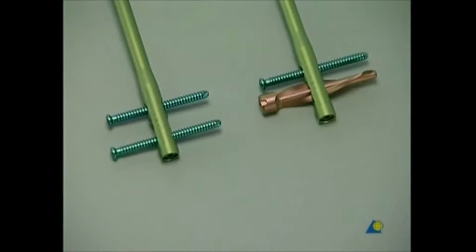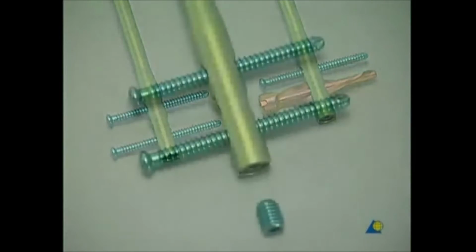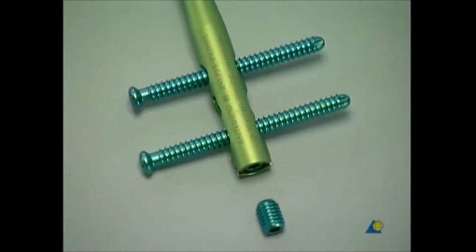There are two options for distal locking: standard locking shown on the left and spiral blade locking shown on the right. The standard locking method is indicated for non-osteoporotic bone and a simple supracondylar fracture morphology. Locking is achieved by means of two 6 millimeter self-tapping locking screws and an end cap.